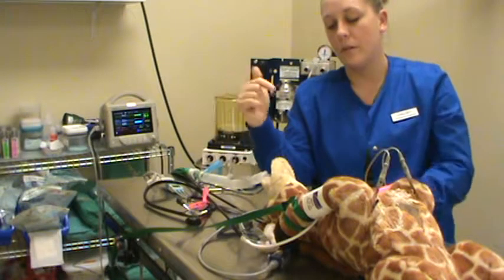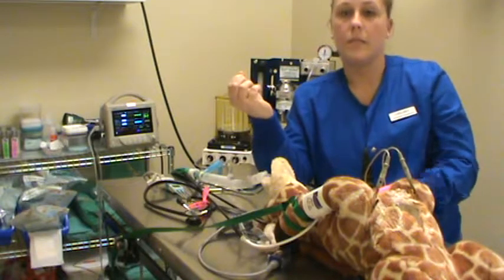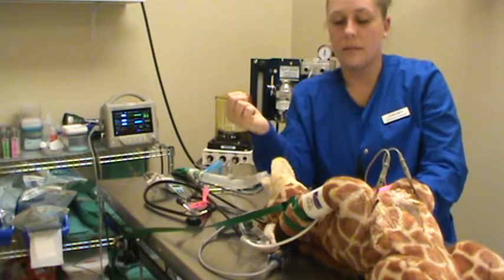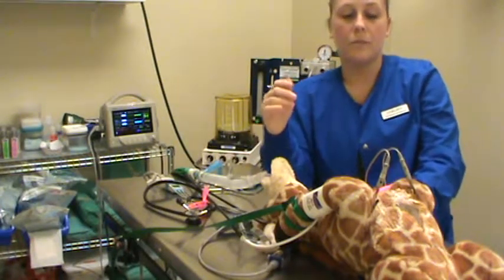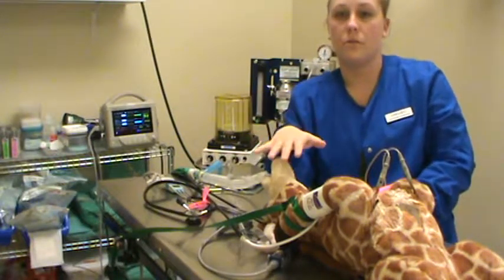They're going to have the corneal, the palpebral, probably the toe pinch, the deep pain. So we're going to check those reflexes and make sure they're still present to evaluate what plane we're in.